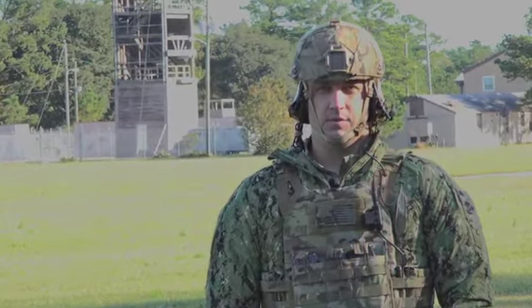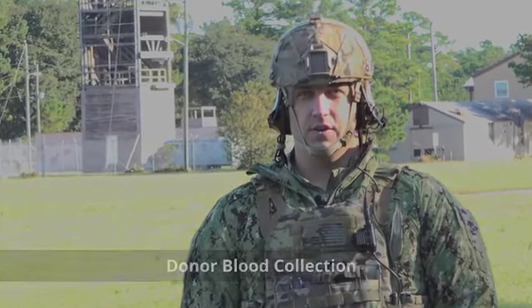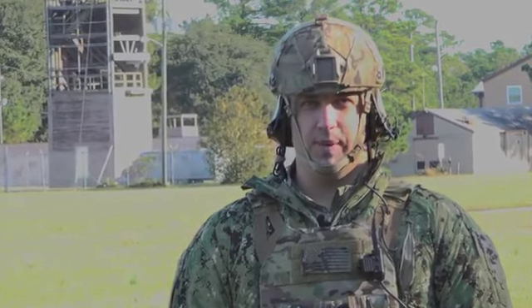Hello, I'm Brad. I'm an active duty hospital corpsman. I'm going to show you the proper steps for collecting blood from an identified donor for a casualty in hemorrhagic shock requiring a life-saving blood transfusion on the battlefield.